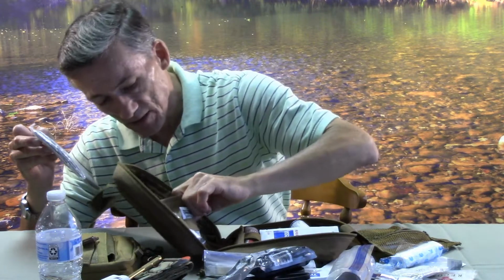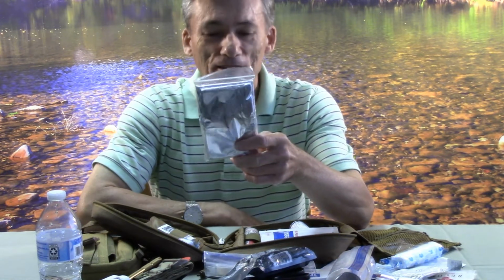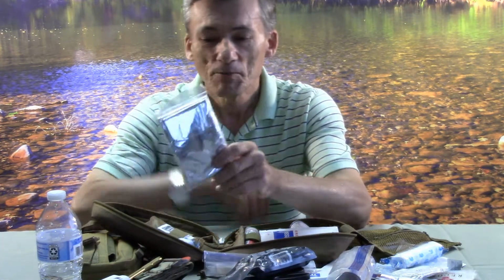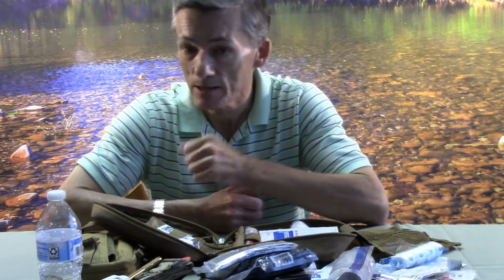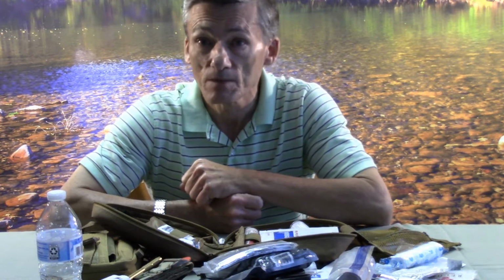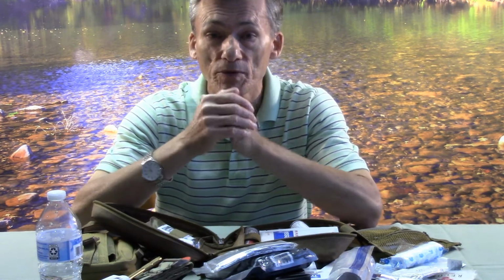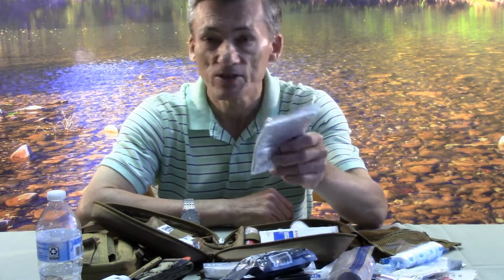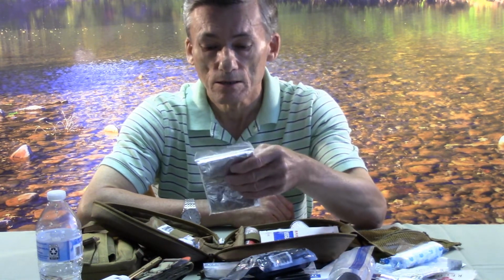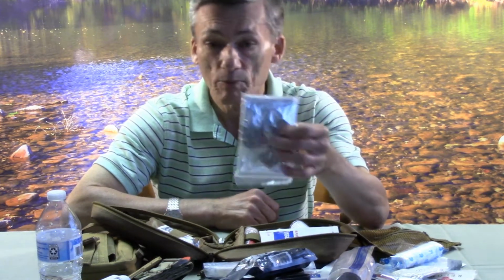And I think this might be the last item here, a survival blanket. Thank you, John. If it weren't for John, I can't tell you how many things I would have forgotten. But yeah, this survival blanket. One thing a lot of people don't even think about when a person is going through a traumatic injury is a lot of times they can go into shock, or they lose a lot more body heat than they would if they were healthy. Now, obviously, if it's a cold situation, you're always maybe going to be thinking about that, but it could be 80 degrees outside, and if a person is losing a lot of blood, undergoing a traumatic situation, it might be a good idea, once you've treated the wounds, to wrap them in one of these, just to keep their body heat in there so that they don't lose it.